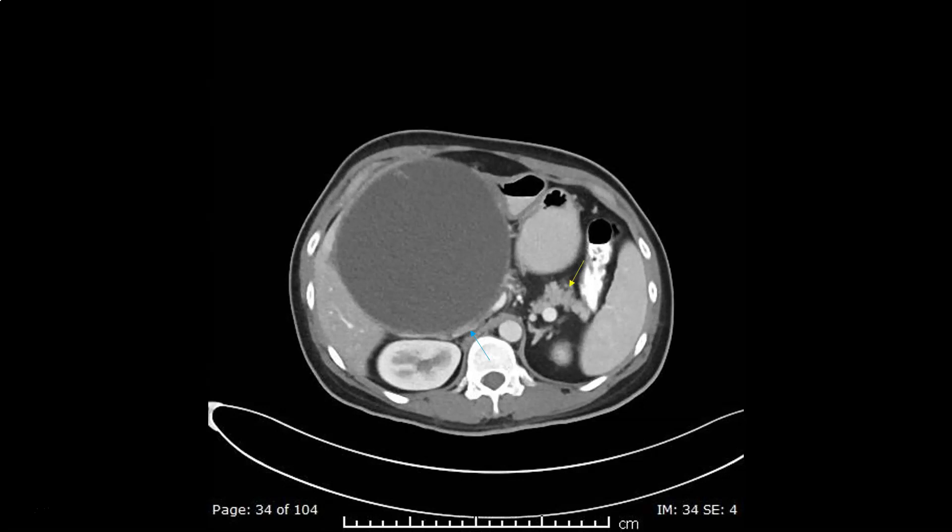The blue arrow shows the inferior vena cava as it is compressed entirely by the lesion, making it a direct posterior relation to the lesion. The yellow arrow shows the atrophic tail of the pancreas.